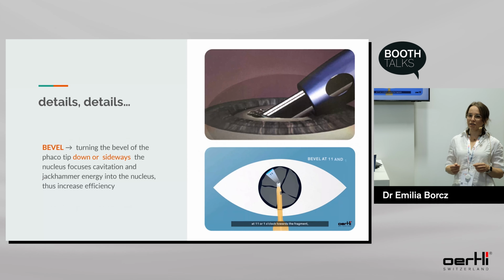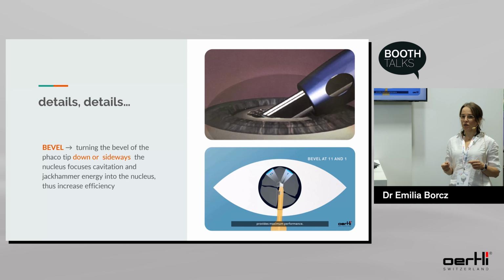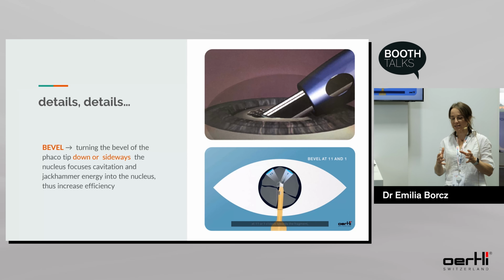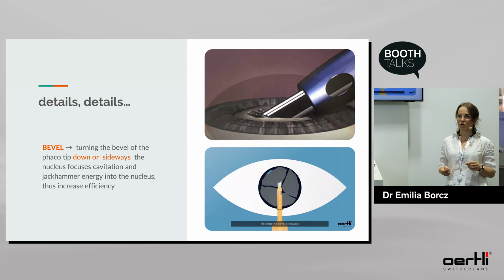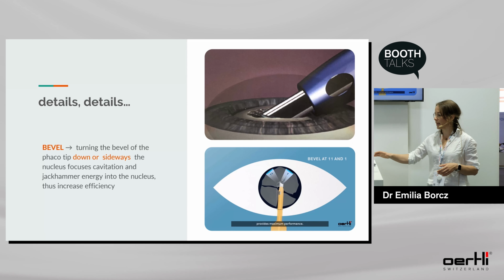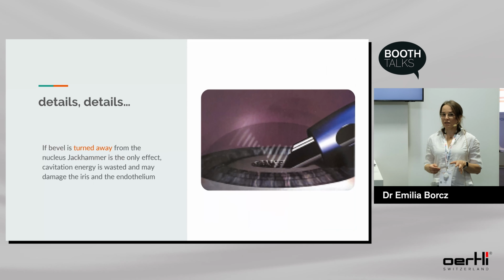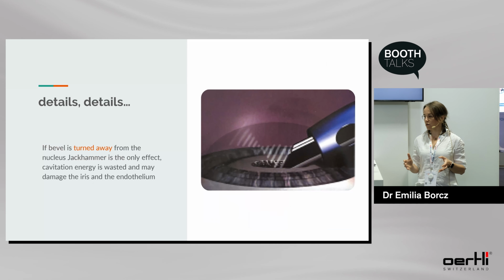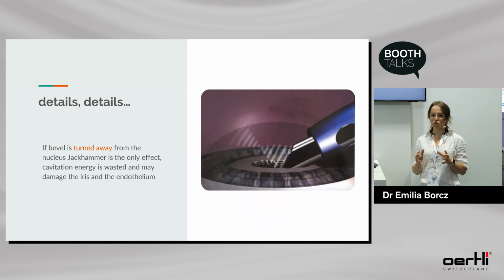Another detail that I pay attention to is how I hold the bevel. I try to use it bevel down and sideways to go into the fragment that I want to catch. We have to remember that during surgery we use not only jackhammer energy but also the cavitation effect. And the cavitation effect may be our friend, but sometimes our enemy. It does not mean that I don't use bevel up at all. I just try to reduce it because with the cavitation effect we may destroy endothelial cells.